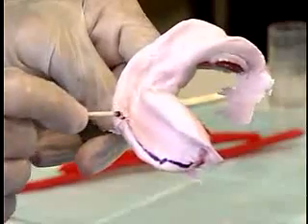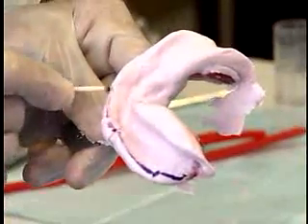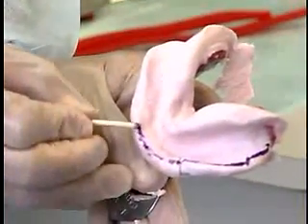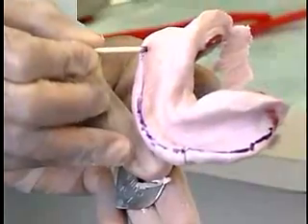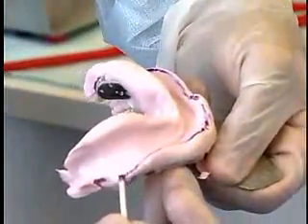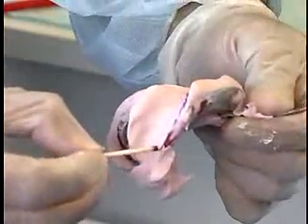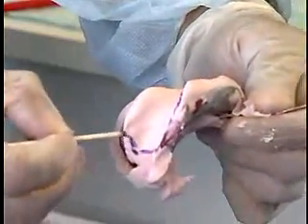Disinfect the impression using the current recommended surface disinfectant for 10 minutes in a sealed bag prior to proceeding to the lab. Alginate impressions tend to be overextended, so the denture outline should be drawn on the impression with an indelible stick. This outline will be transferred into the cast and will be helpful to fabricate the custom tray.